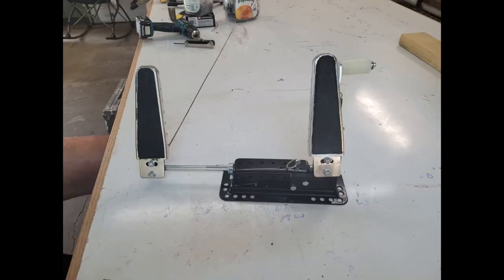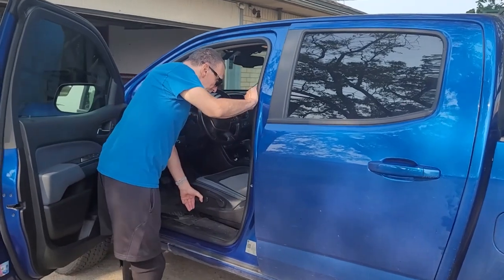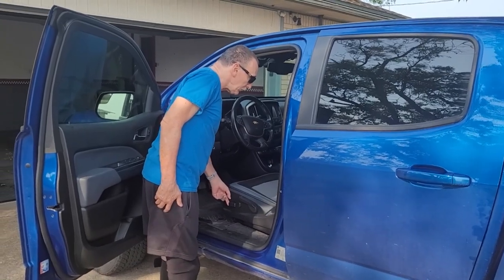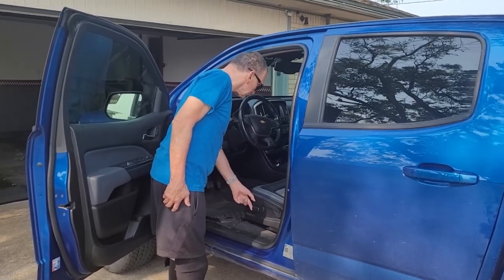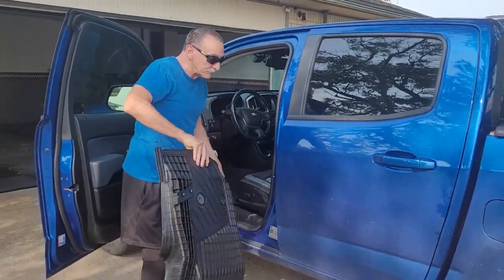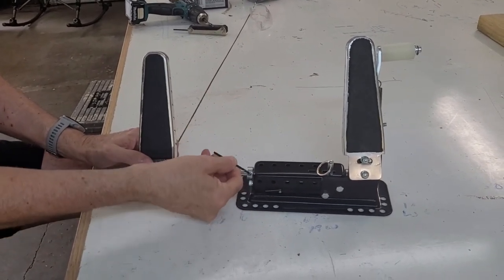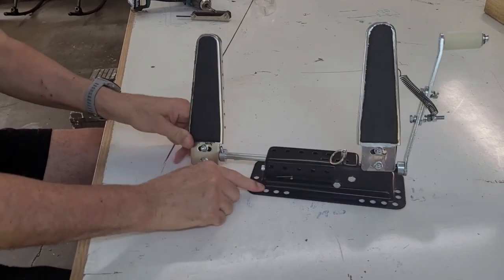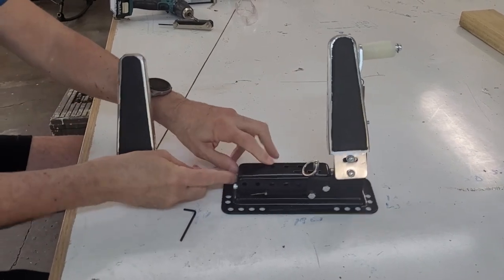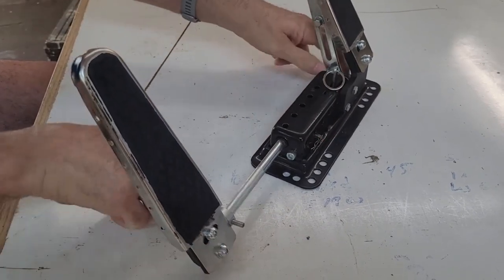Today we are going to show you how to install an AMABLE Motion Mobility left-footed gas pedal in a 2020 Colorado. The first step is to put the vehicle in a location where you can get the doors all the way open so you can work on the inside. Slide the seat all the way back and pull the floor mat out. When you take it out of the package, the assembly has two pedals. The right pedal is really not a pedal — it's a pedal cover. The left pedal is the gas pedal, and there's a white roller on the right side that rests on the factory gas pedal.